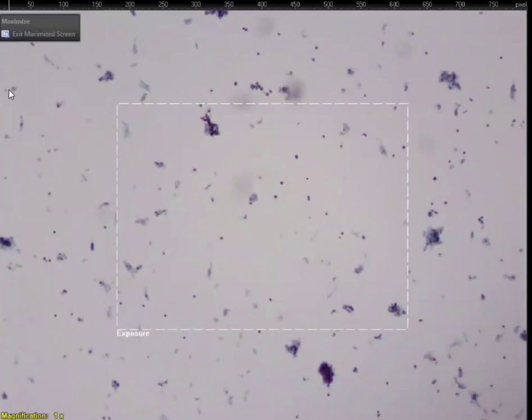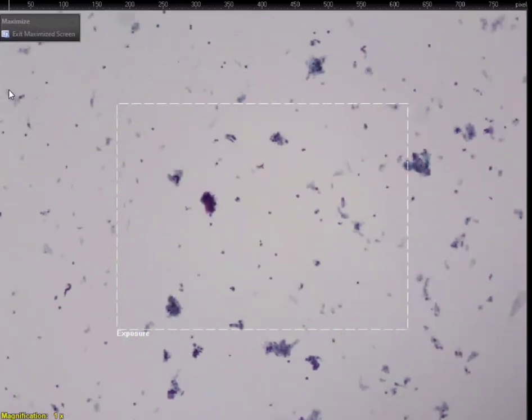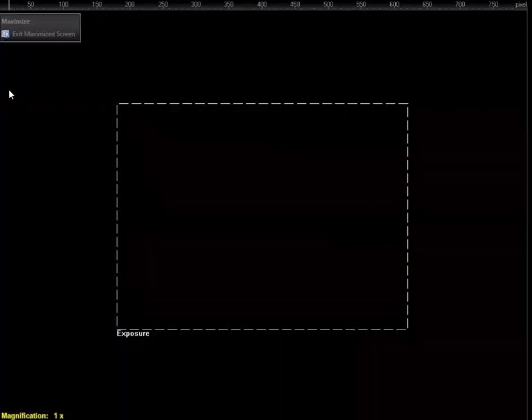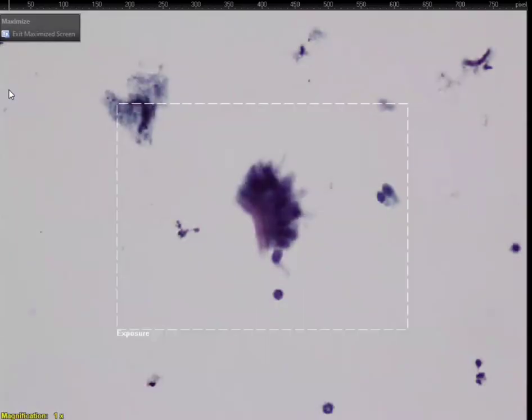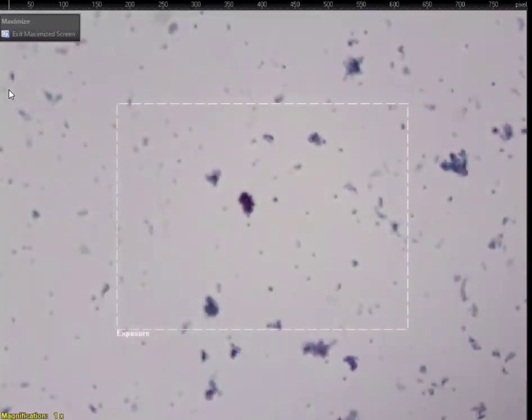Now you understand what paucicellular looks like. Few cells, and not only that, we've got all this heavy respiratory contaminant. Sometimes it can look like a two-cell population, and absolutely yes, there is a two-cell population, but our second cell population is normal bronchial cells. See that? Everybody comfortable with this? Any questions about this?